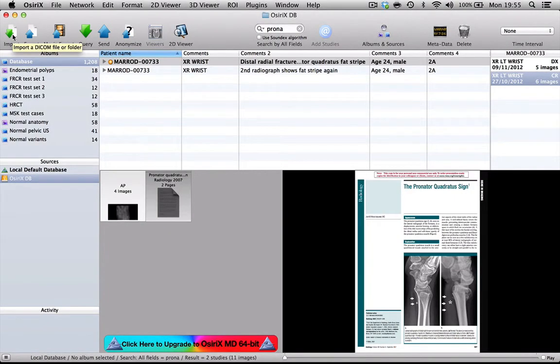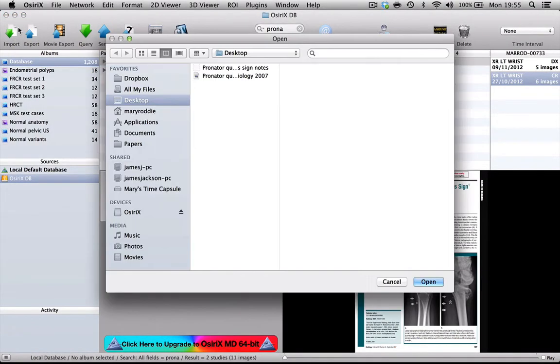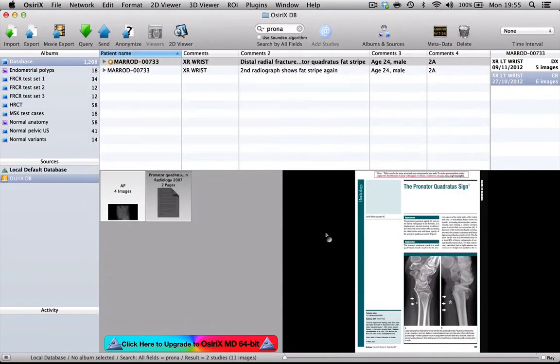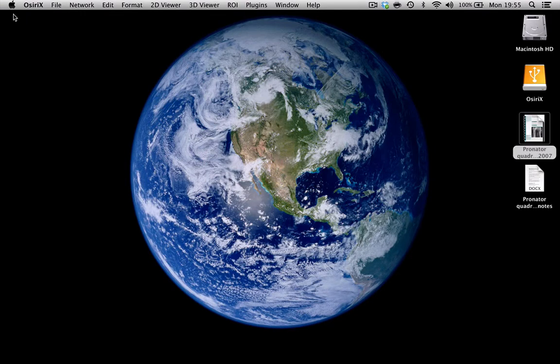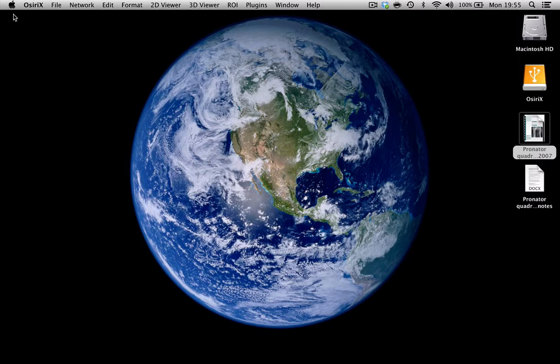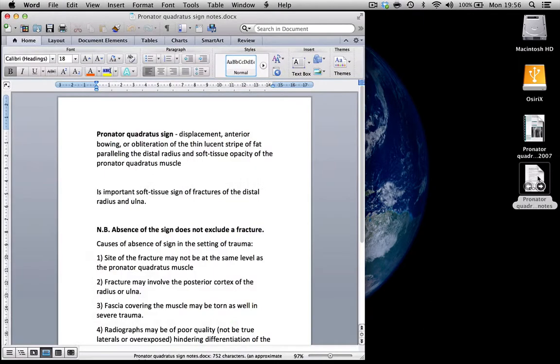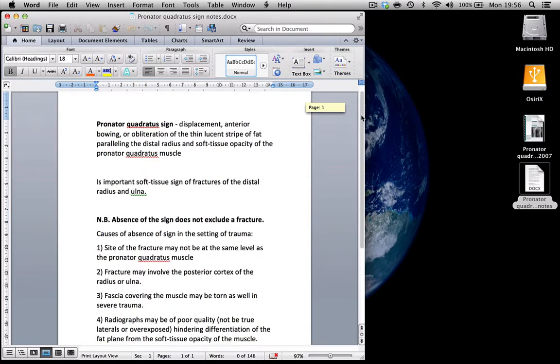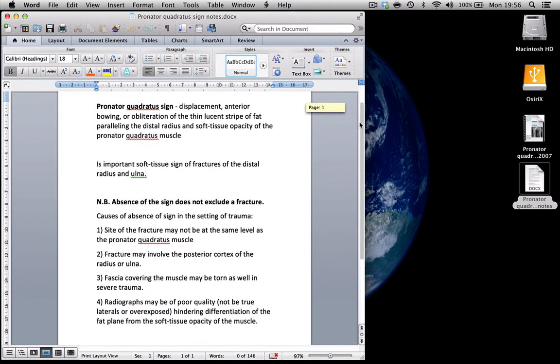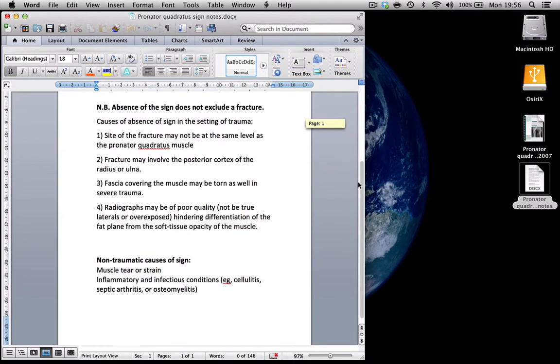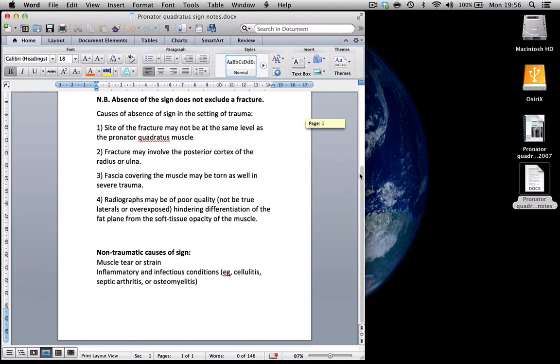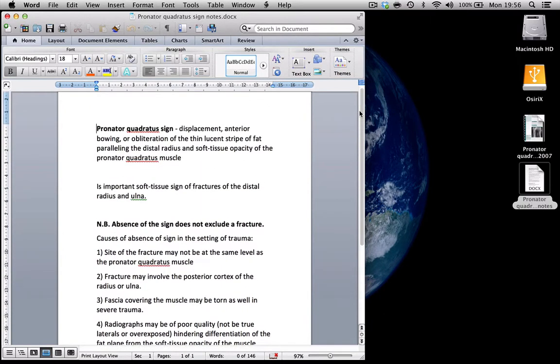Now the other thing that you will occasionally want to add into a case is just a simple Word document, maybe with some clinical details about the case or a simple differential diagnosis list. And I'm going to show you how you can do that as well. Here is a little Word document of notes that I've made just about the pronator quadratus sign, probably a little bit less information in this than there is in the radiology article.